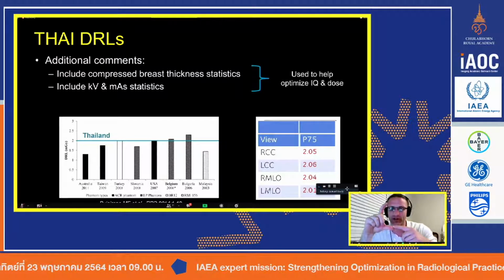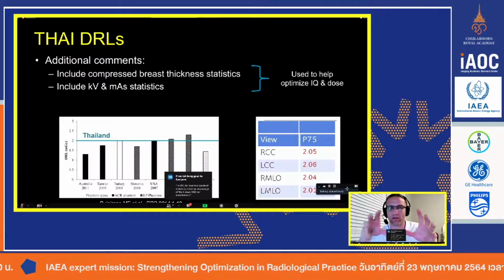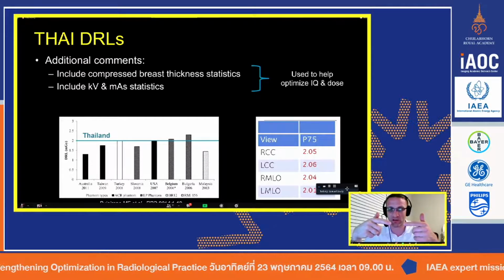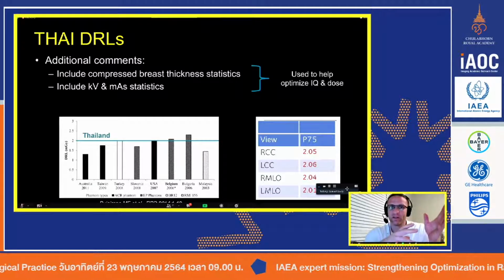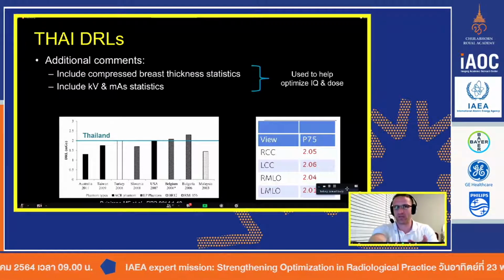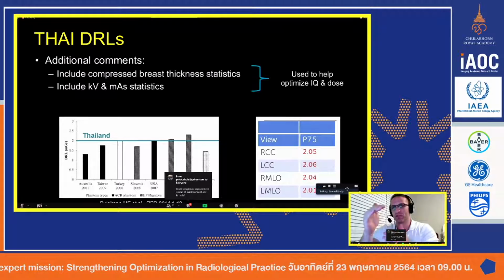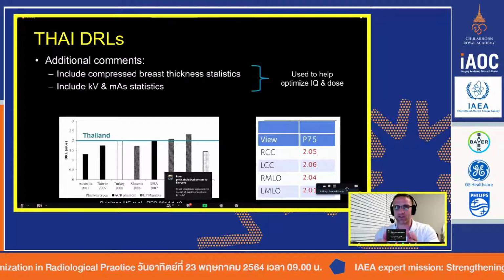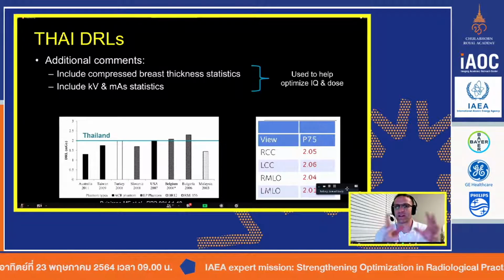You know the compression thickness, the breast thickness, the kV, the mA, all of that. It's all there. At that point, you could calculate the mean glandular dose, or the AGD, and report the doses for DRLs there. So if you only use the dose software system, you probably won't be able to do a lot of this higher level stuff. You'll still be able to get your DRLs, and you could maybe still do a questionnaire where the hospital says, this is our average dose, this is our average thickness, these are our technique factors.